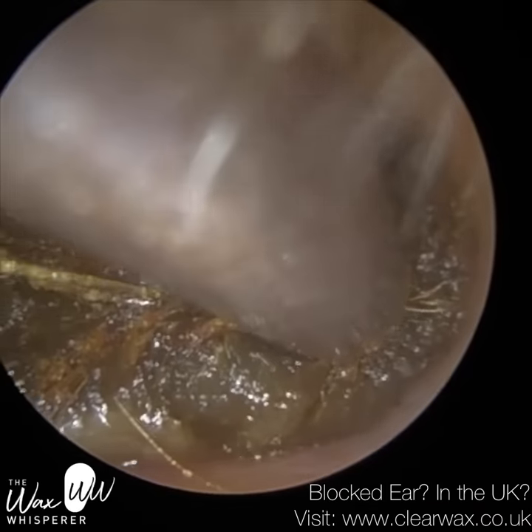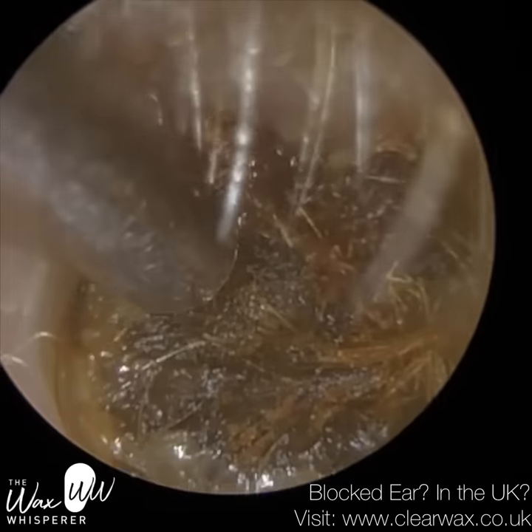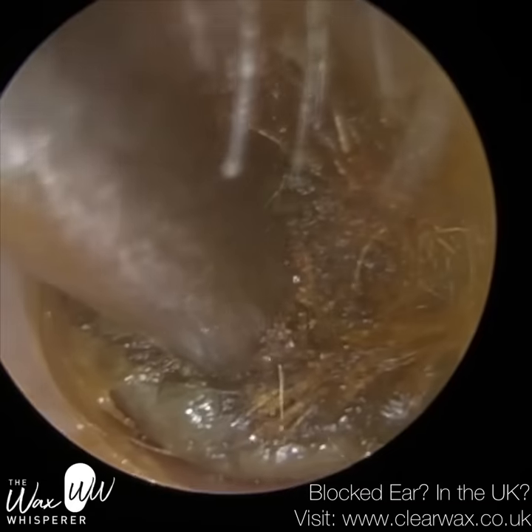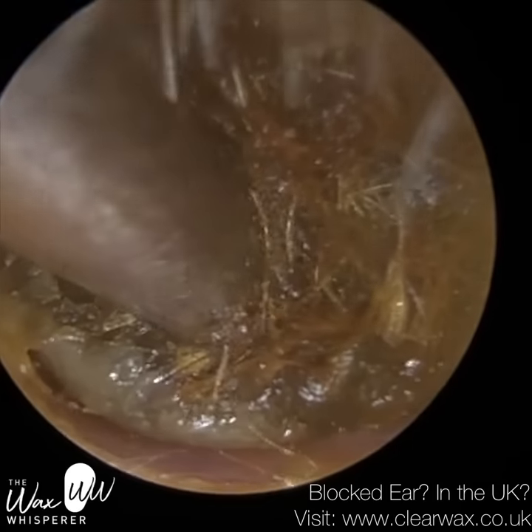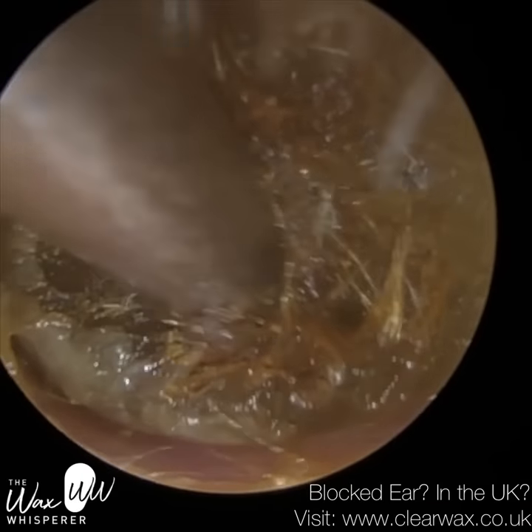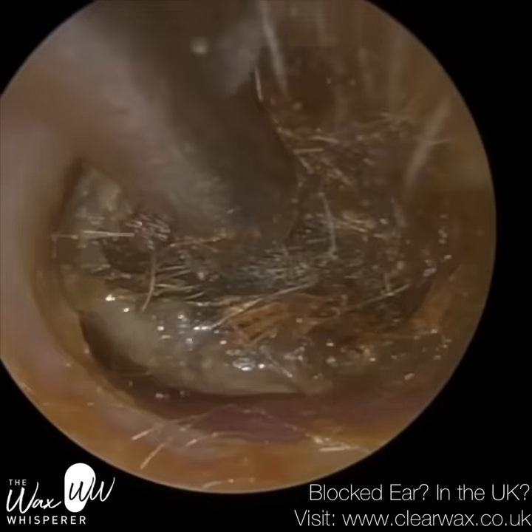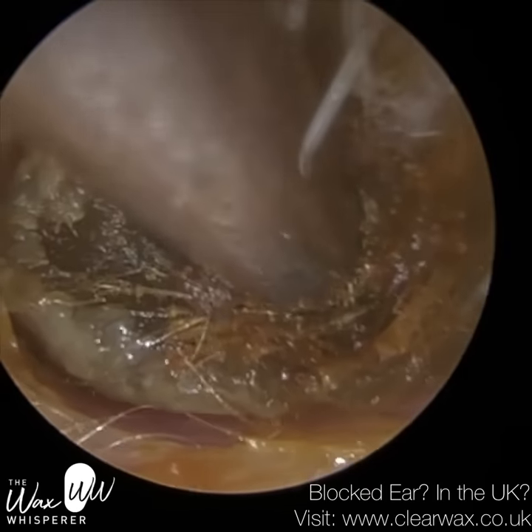So I've got probably the outer quarter out. We're now, I would say, on the bony part of the ear canal. That previous wax was on the cartilage. Now we're working on the bony part. We've just gone past the second bend. That's a good landmark to separate the cartilage portion of the ear canal and the bony part. So anything towards me before that second bend is likely to be cartilage, and anything beyond that second bend is likely to be the bony part of the ear canal. The ear canal is divided into three: the outer third cartilage, the inner two thirds bone.